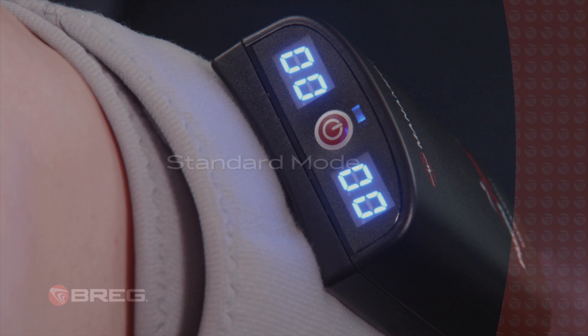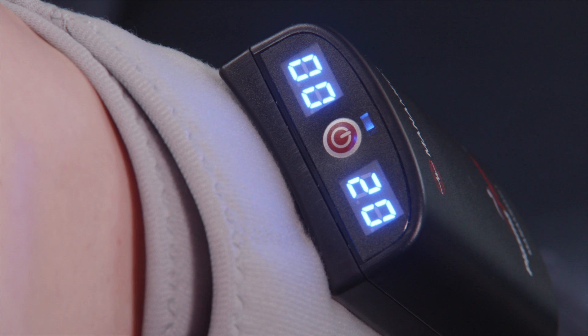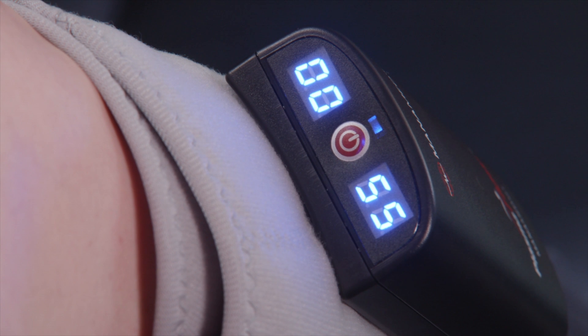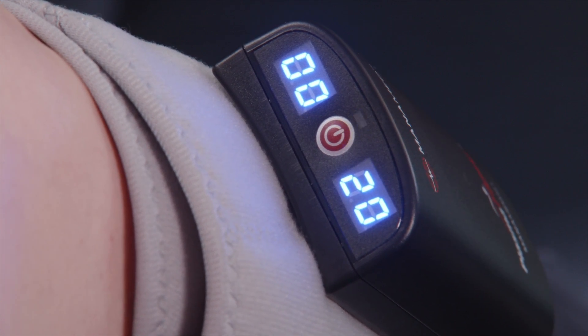In standard mode, the unit will inflate to 55 mmHg and then deflate to 0, as shown on the display to the right side of the power button. There will then be a rest period of 50 seconds before the unit inflates and deflates again.